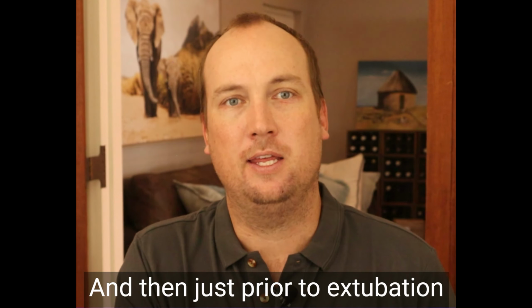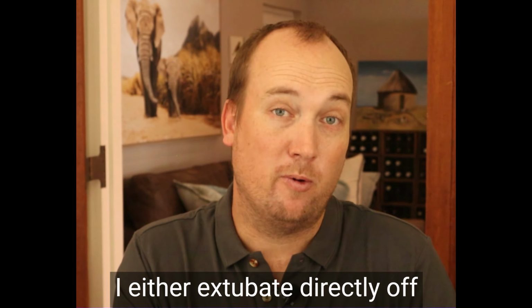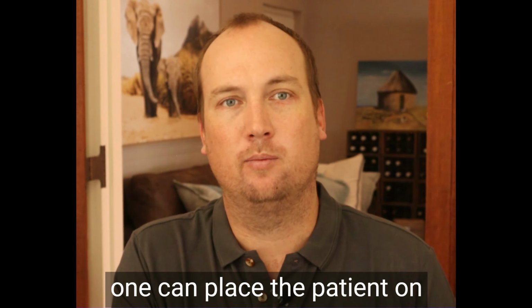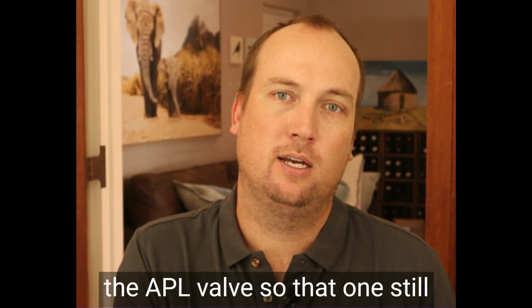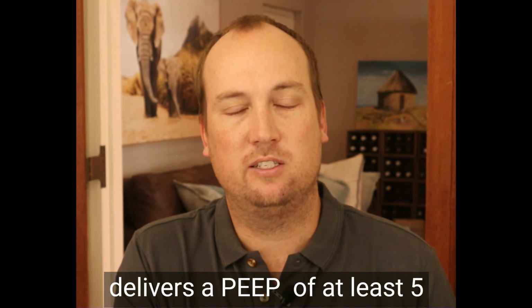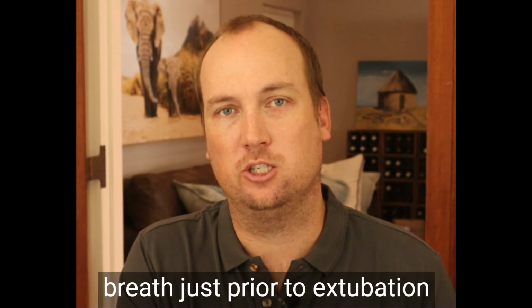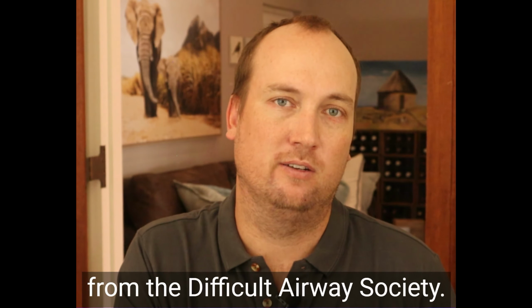And then just prior to extubation, I either extubate directly off pressure support ventilation, which I'm comfortable doing, or prior to the extubation, one can place the patient on spontaneous breaths and adjust the APL valve so that one still delivers a PEEP of at least 5 to 10 centimeters of water, or so that one can deliver a positive pressure breath just prior to extubation, which is what is recommended by the extubation guidelines from the Difficult Airway Society.